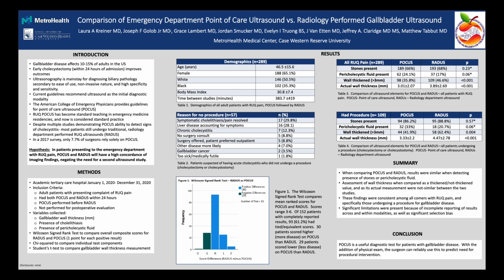We scored each individual element, got an aggregate score per study, for both radiology and ED, and compared that aggregate score to see how similar those scores were. And what we found, that graph in the middle, is that most of the studies had no difference in the two different scoring systems, right? There was a little bit of variability on either end, but most of them showed profound similarity between the ED performed and the radiology performed ultrasound.